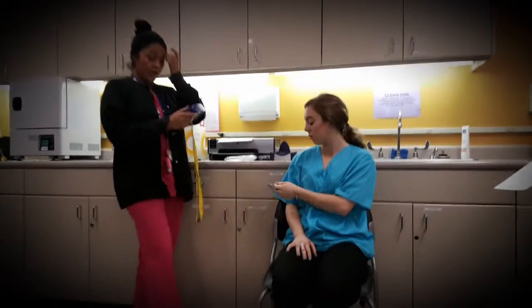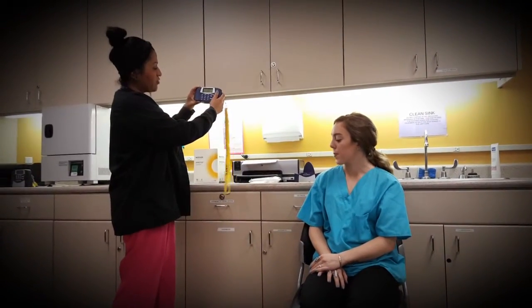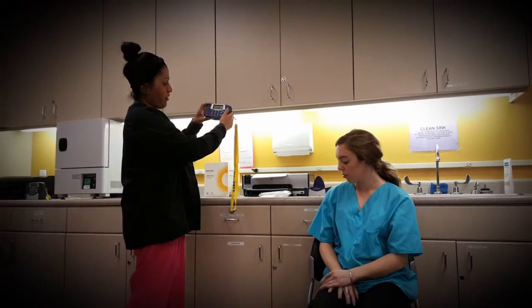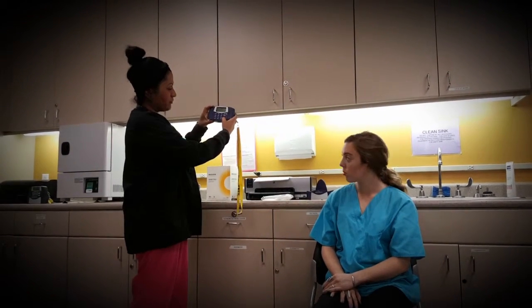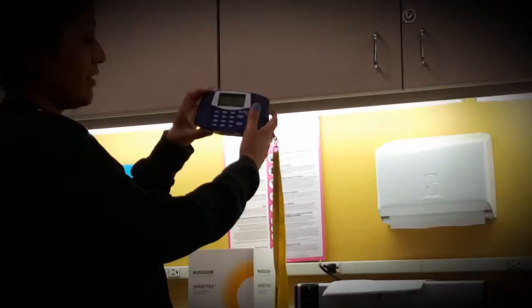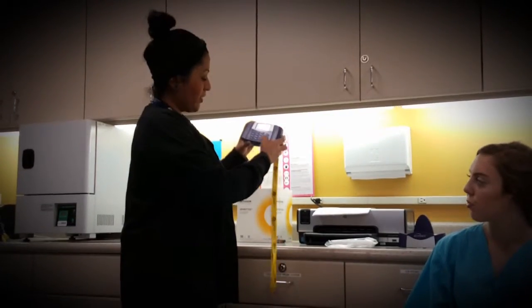The main screen gives you a couple of options: perform test, view results, print results, and configuration. You won't be doing configuration — select perform test and hit enter. It then asks you to select a test: new test or recall. You can recall a previous test if you didn't get a chance to print it. We're going to select new.